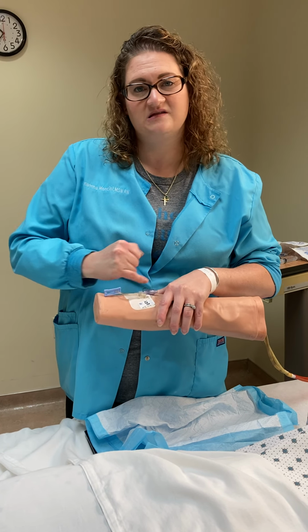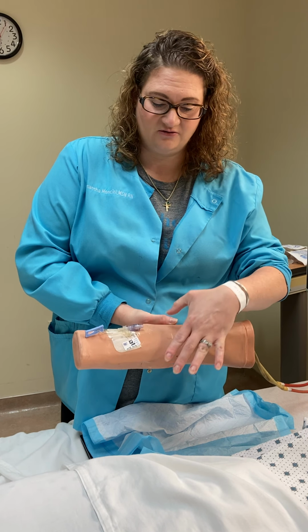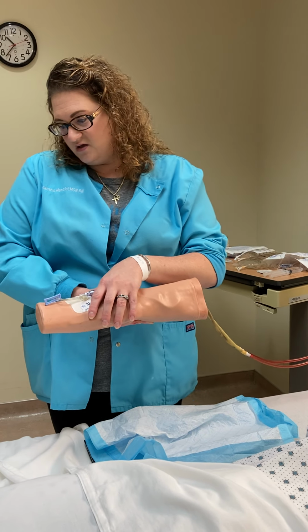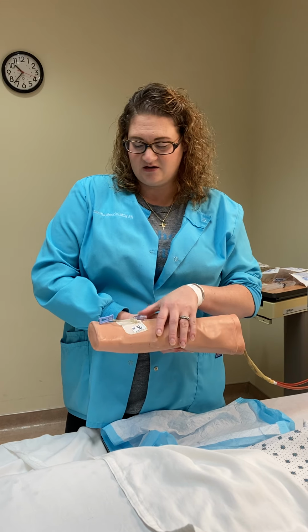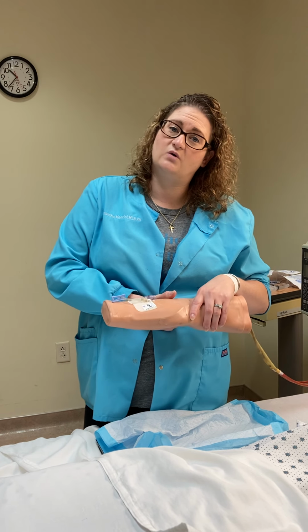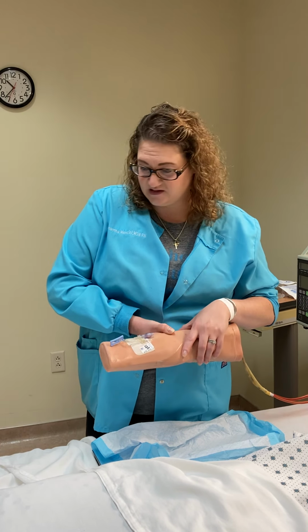If there's an infiltration, that's where the IV dislodges from the actual vein, and the fluid starts to spill out into the soft tissue around the vein. Usually causes a little bit of a bubbling or swelling appearance. There might be a little bit of redness, not always. So we can elevate the extremity. We could put a cool or a warm compress depending on whether there was medication that was infiltrated into the area. Of course, we would DC that line and not use it.